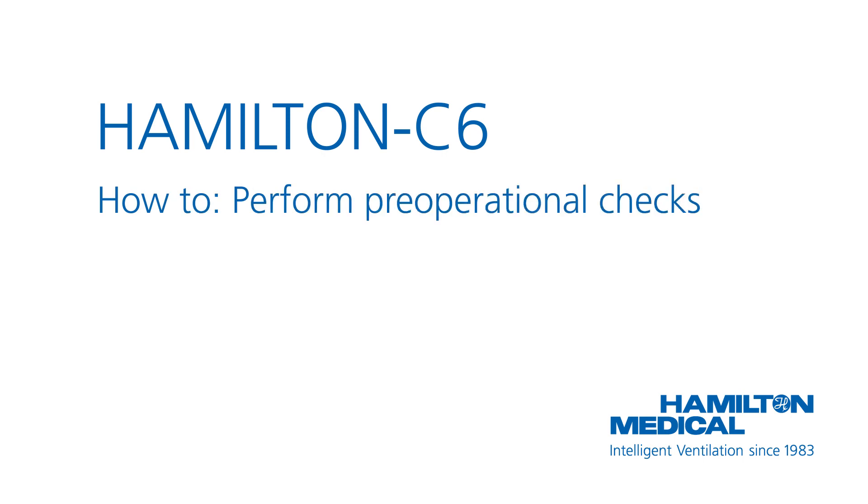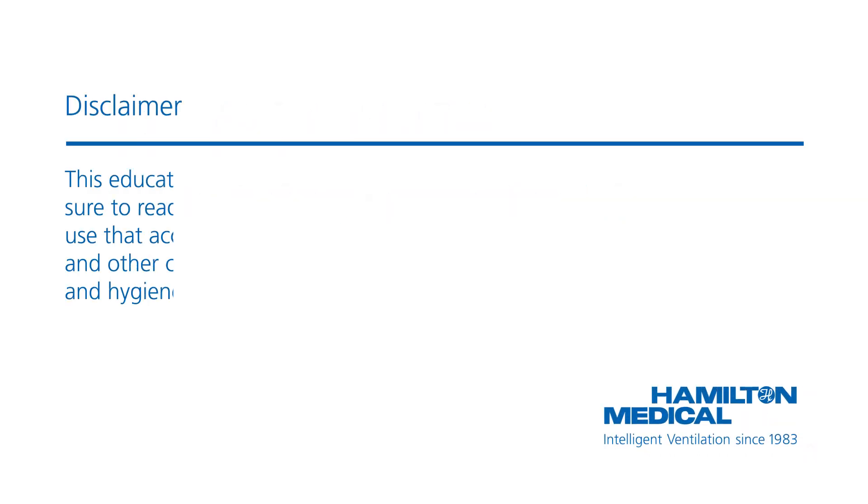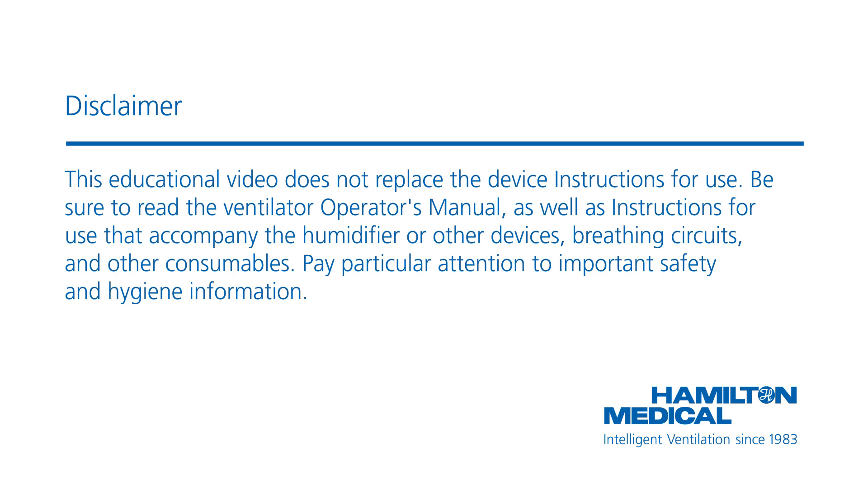This how-to video will show you how to perform the pre-operational checks, including calibration of the flow sensor and a breathing circuit tightness test. You will also learn how to perform calibration of the O2 sensor and zero calibration of the CO2 sensor. This educational video does not replace the device instructions for use.